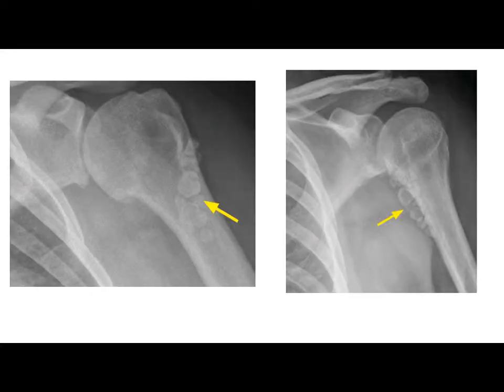This is what we see in this X-ray at the biceps tendon. You can see there are multiple rounded dense lesions of almost the same size. While in osteophytes of osteoarthritis, they tend to be variable in size, and usually they tend to be more calcified than this. However, erosion also occurs, of course, in osteoarthritis by default.